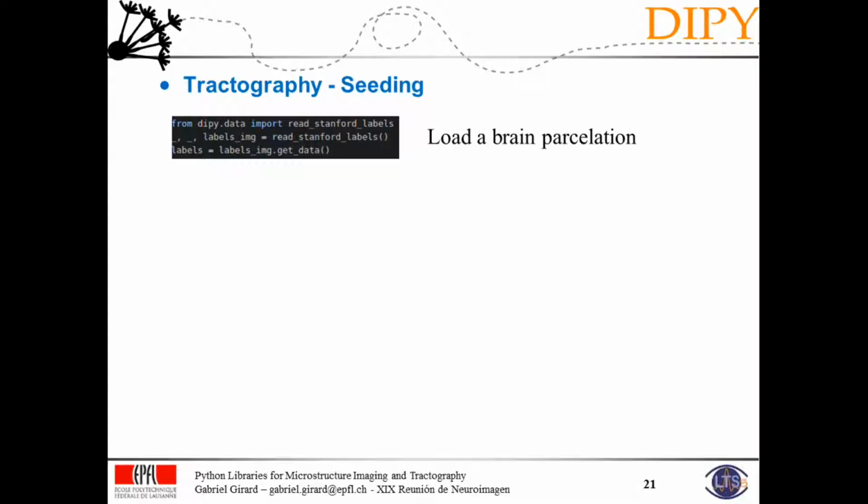So you don't want tractography to stop in CSF because it's not anatomically plausible for the white matter. The axon shouldn't start from the cortex and stop in the ventricle, for instance. It shouldn't go through the ventricle either.